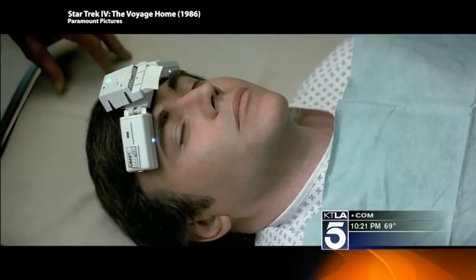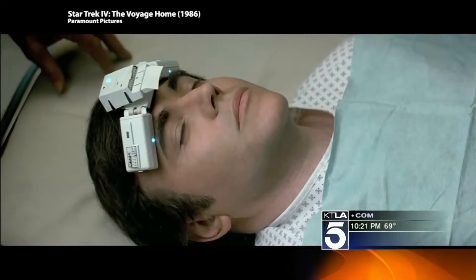The team is still years away from using this laser on patients, but this giant leap could come long before people live in deep space. If the digital camera technology improves and the LCD technology improves, I think there is a really good chance that we'll be able to start doing this in 10 years or less. At Caltech, Dave Malkoff, KTLA 5 News.